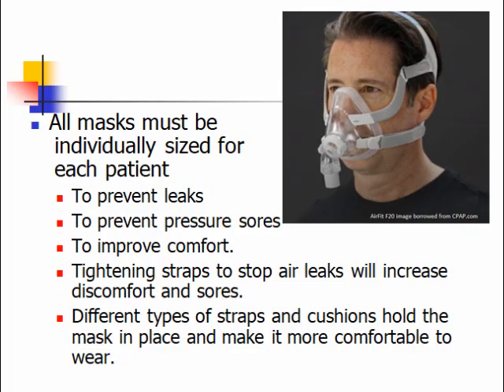And one of the things you should not do for yourself is tighten these straps up so that the leaks stop. If you're having leaks, then you probably need a different mask, different types of straps, different types of cushions, to hold the mask in place and make it more comfortable to wear and less likely to leak.